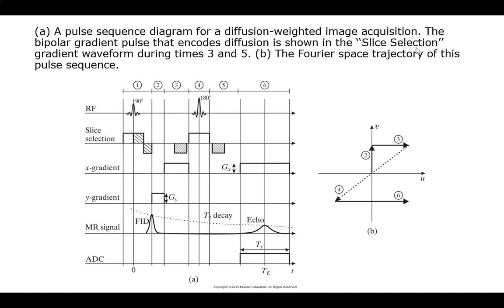One of the key things you'll note is I now have to counterbalance your weights. This is really the big difference with the diffusion weighted. Again, because now I want to make sure that it's nicely balanced. The other one I say, that's good enough, right? It's flipped, it'll be basically okay, because I wasn't too concerned about what that effect was.